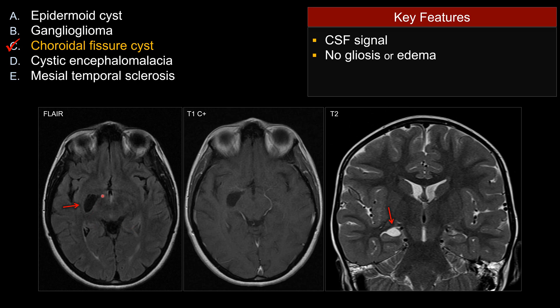On FLAIR, you also see no abnormal signal surrounding the cyst. So there's no evidence of gliosis or acute parenchymal edema. There's no enhancement. So everything we see so far has a benign imaging characteristic, and this is what choroidal fissure cyst should be — benign.